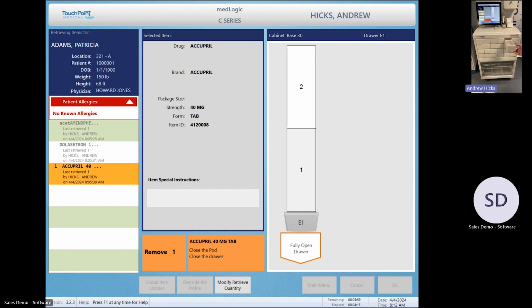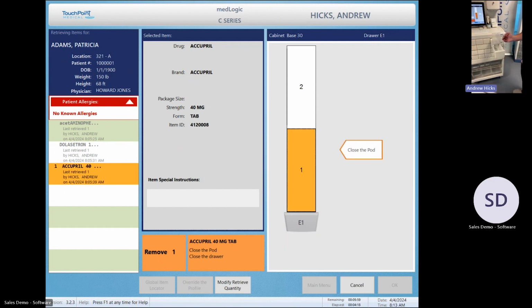This last drawer happens to be what we call a lidded drawer. So this is for single item access. So when that drawer comes fully open, that lid pops open, you now only have access to that one item. This particular size is what we call a double lid. There are also single size lid and triple size lids. So this particular drawer has two double lids.